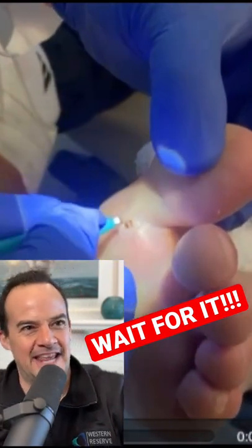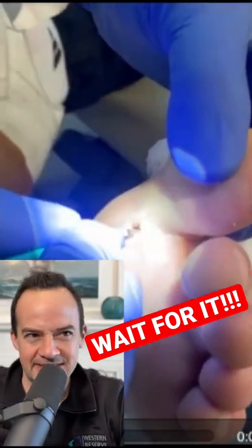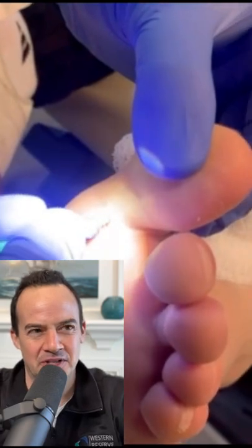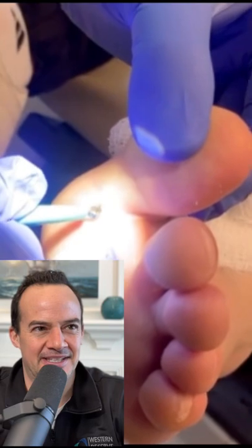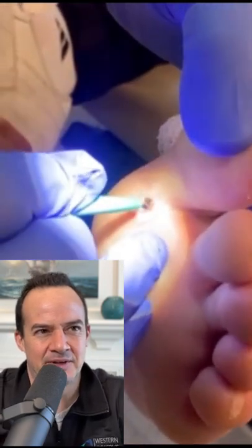What's up guys? So this patient has a splinter in their foot, and sometimes these can be very difficult because you don't know where it's at. You can't see it. You can't see how deep it is. So let's see what's happening here.